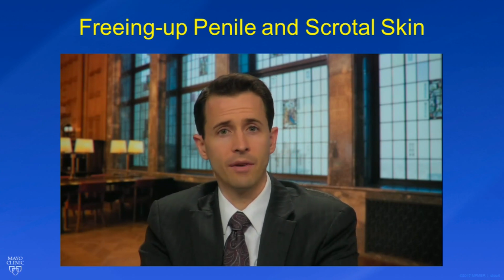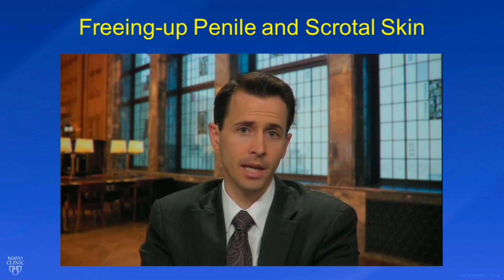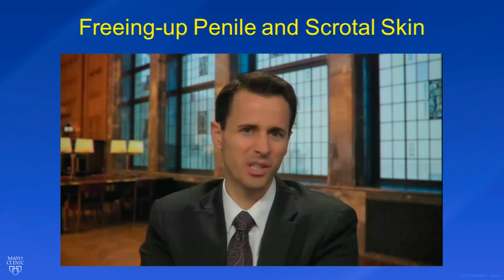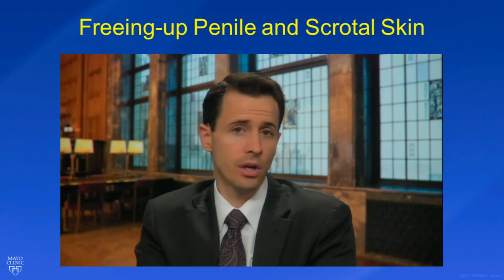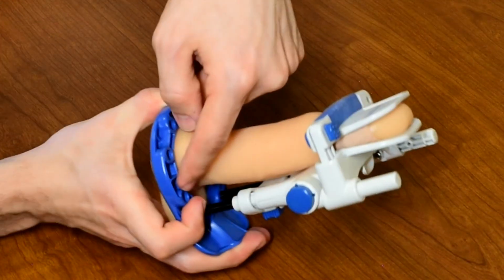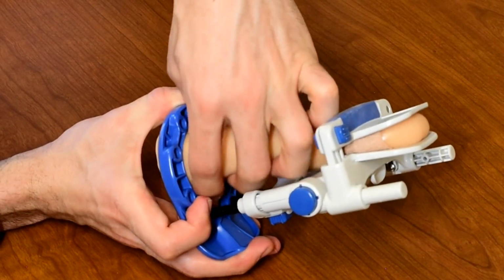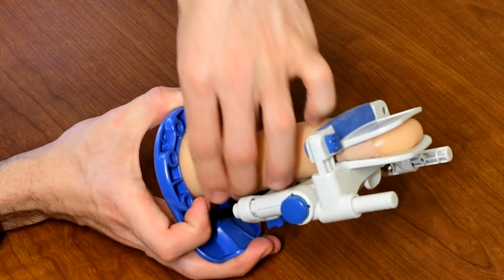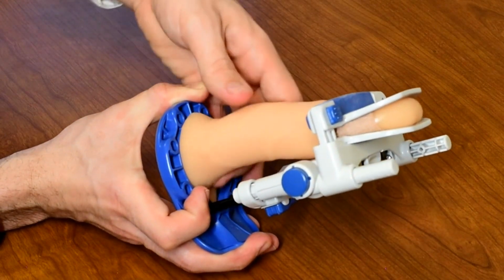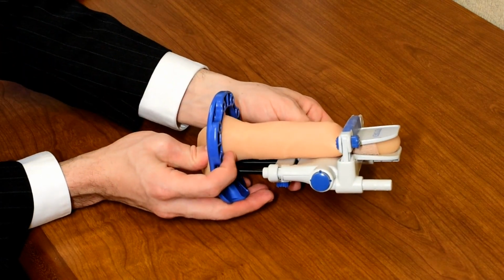This occurs because when the device is placed, the skin pulls tight and prevents it from delivering the traction to the penis itself. Instead, it's applying the traction to the penile skin, which is not the goal. This incorrect use can also result in penile pain, and it most often occurs on the underside of the penis. To prevent this from occurring, simply run a finger around the inside of the base ring, as shown here, to free up any areas that you feel may be tight. Also, you can continually reposition the base ring against the pelvis to make sure that as much traction as possible is directed to the penis rather than the other structures. This also often occurs when applying counter traction, and we'll talk about that more in just a minute.